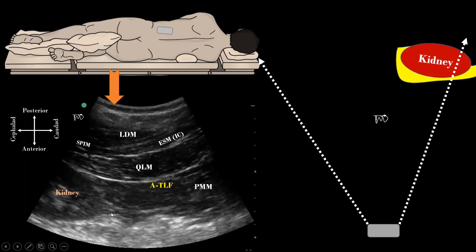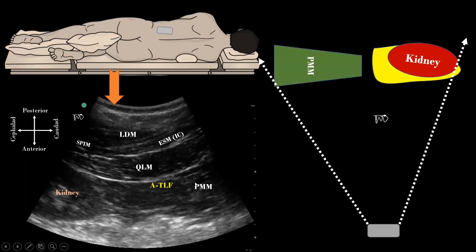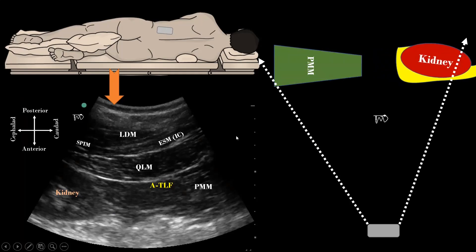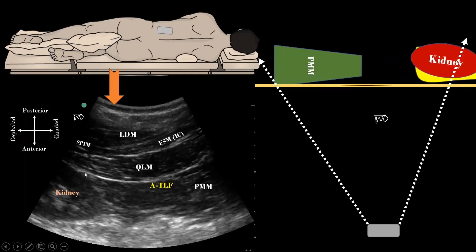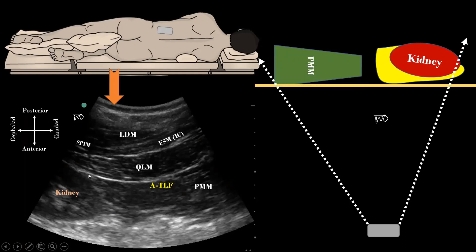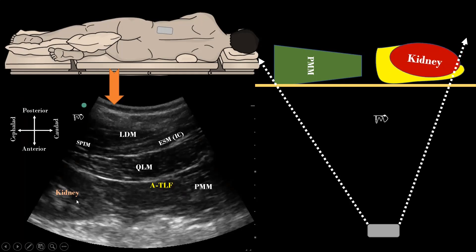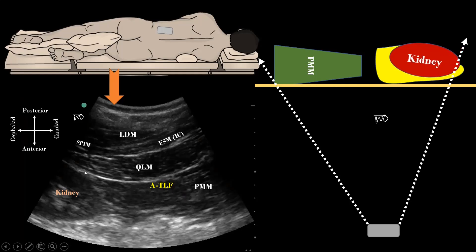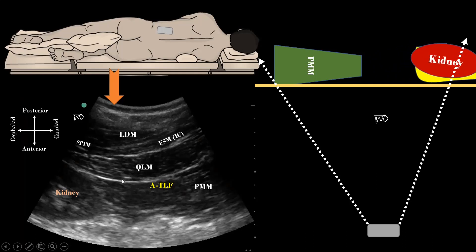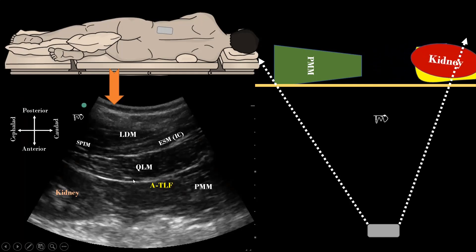The muscle caudal to the kidney is the psoas major muscle. Then identify a hyperechoic line posterior to the kidney and the psoas major muscle — this is the anterior layer of thoracolumbar fascia.